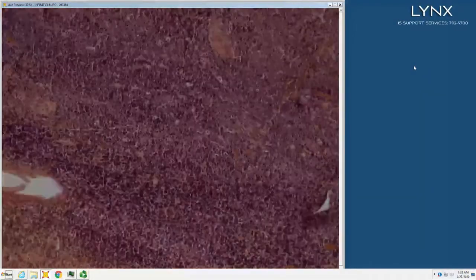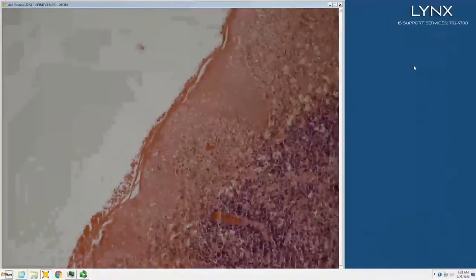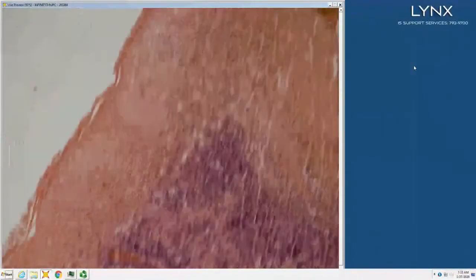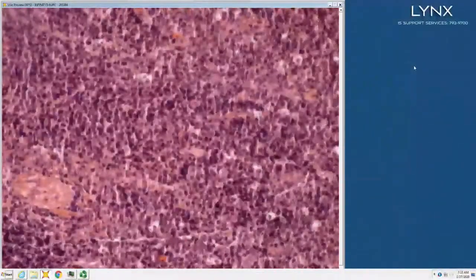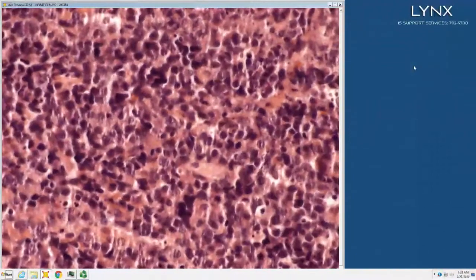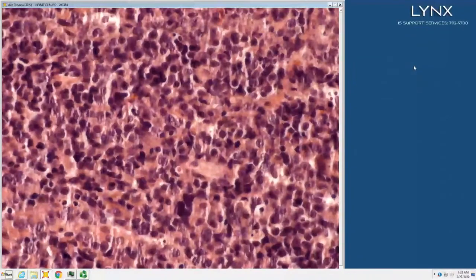This is, you can see someone's burnt the snot out of this slide. You can see there's still epidermotropism. So this was MF. But again, just like in the last slide, these cells are not so... You have some very dark crenated cells that look like shriveled raisins where you can see the notches in them.